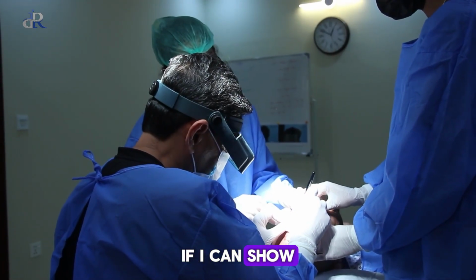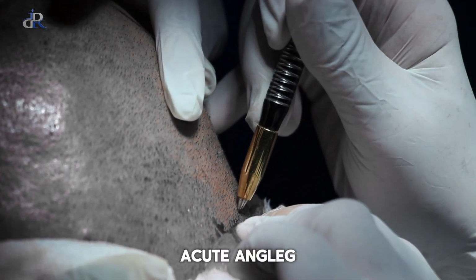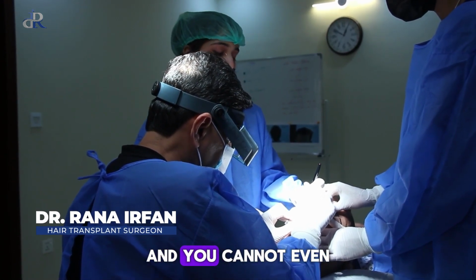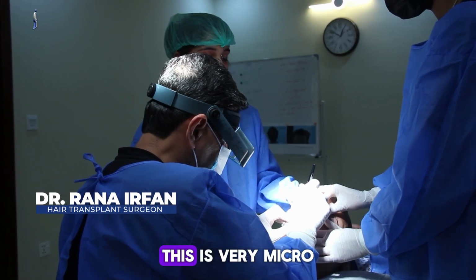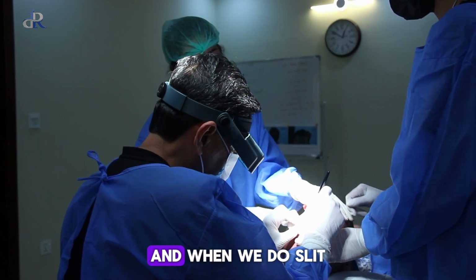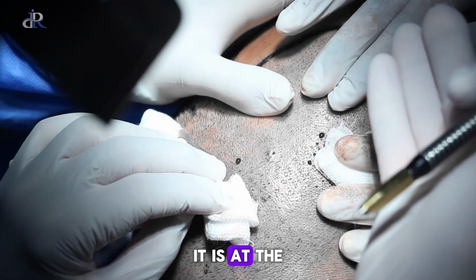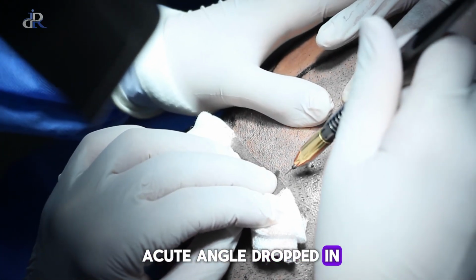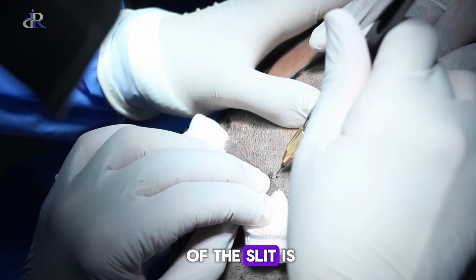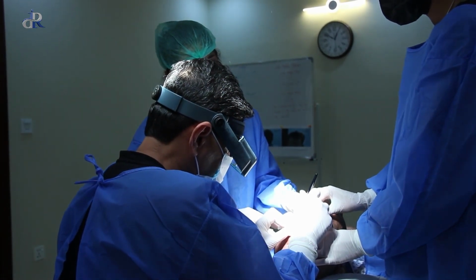The other thing is the size of the graft. If I can show you the slitting, it is at an acute angle. I'm doing it with an angled micro knife. You cannot even see it with the naked eye. This is a very micro knife and it is an angled one. And when we do a slit, it is at an acute angle, dropped in the frontal side, okay? The other one is the size of the slit. The size of the slit is just according to the size of the graft.